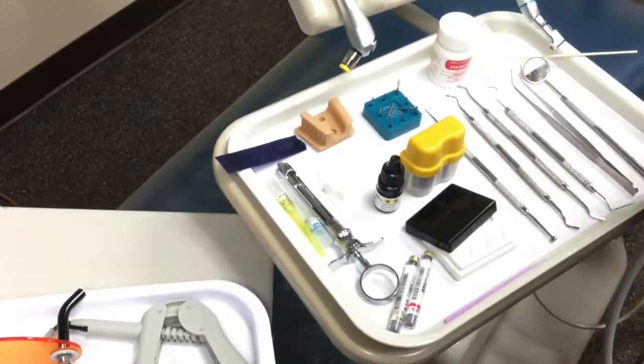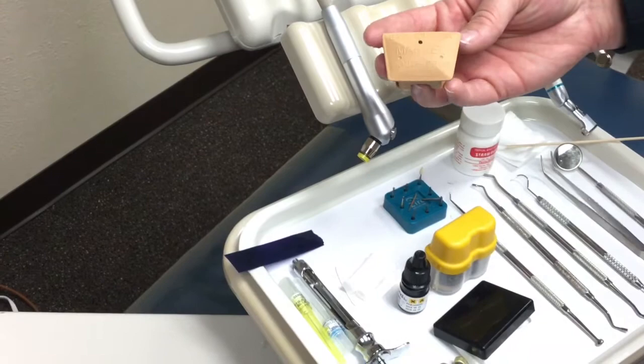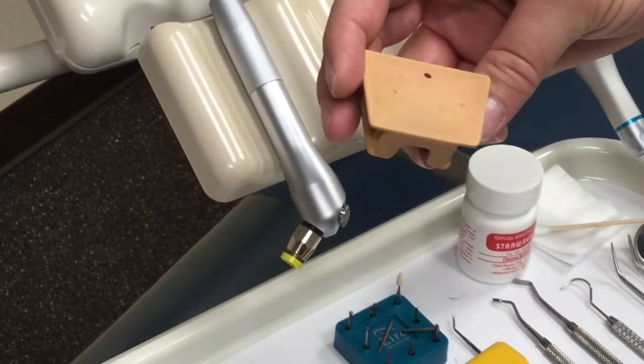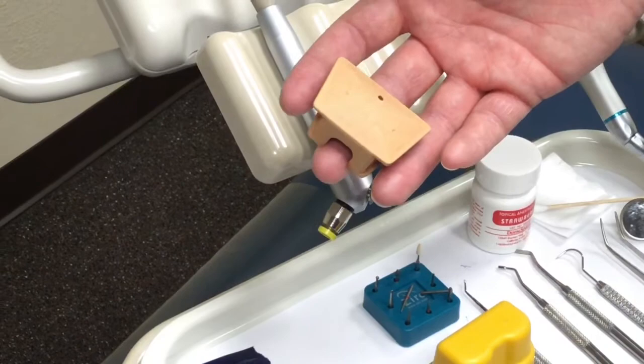I also have on here a bite block, or a mouth prop depending on your office. It helps the patient keep their mouth open and gives them something to rest on if their jaw gets tired. They come in two different sizes — adult size and pedo size. Pedo is typically used for women because women have smaller mouths than men, but if you're not sure, take a look at the person's overall features, and it's never a bad idea to get out both sizes.